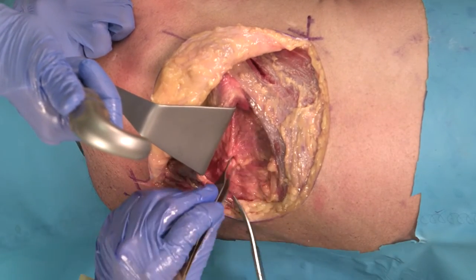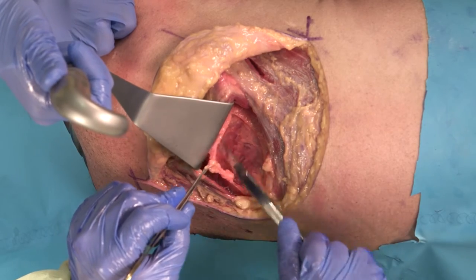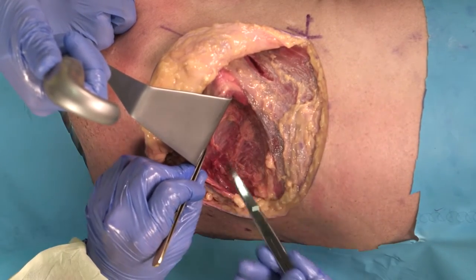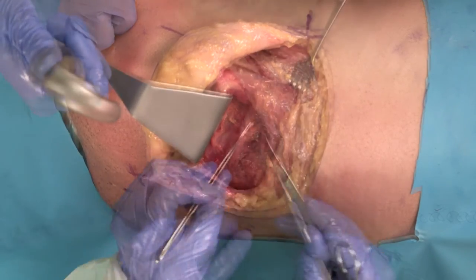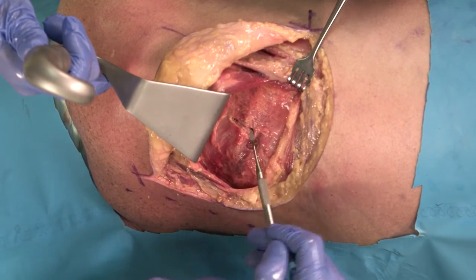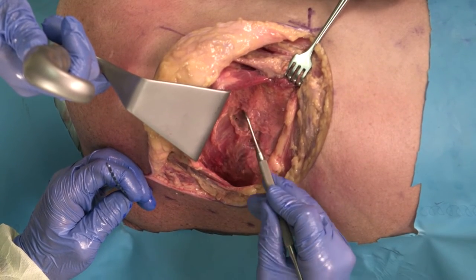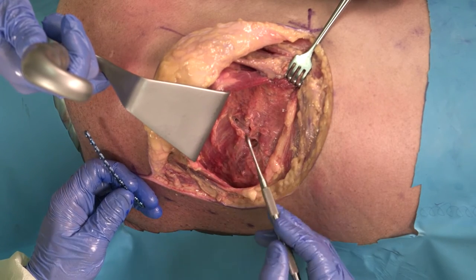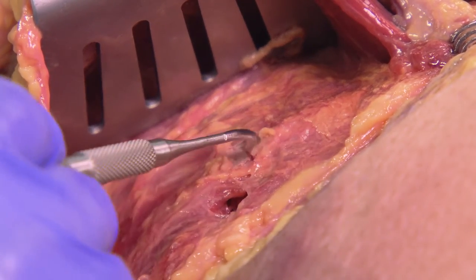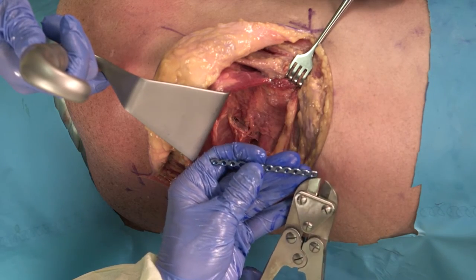Underneath the scapula, a significant bursa is seen. If difficulty is encountered visualizing the ribs, some of this bursal tissue, which tends to be foamy in nature, can be removed. Now we have access to the posterior lateral thorax, and here is one of the ribs. We've encountered a rib fracture on the posterior lateral thorax in a relatively good position, but it can be adjusted with instrumentation. The soft tissue from the fracture site is elevated, but the remainder of the periosteum and soft tissue around this is not elevated unless it is thick musculature — this provides significant blood supply to the rib, and removal of that blood supply will unfortunately limit union and delay things unnecessarily. If the plate is too long, we can use the plate cutters to shorten it to an appropriate length for the fracture.